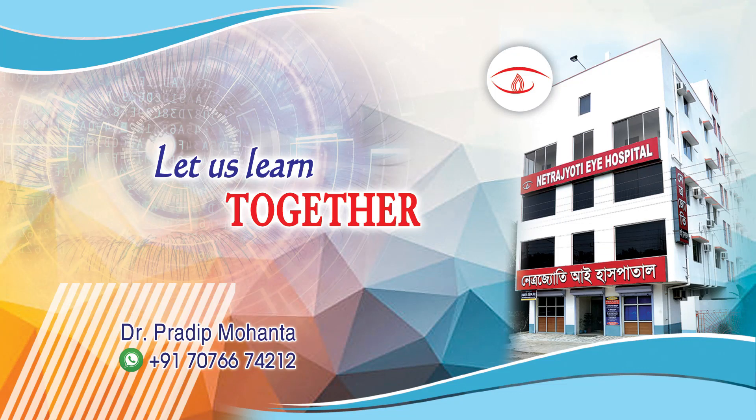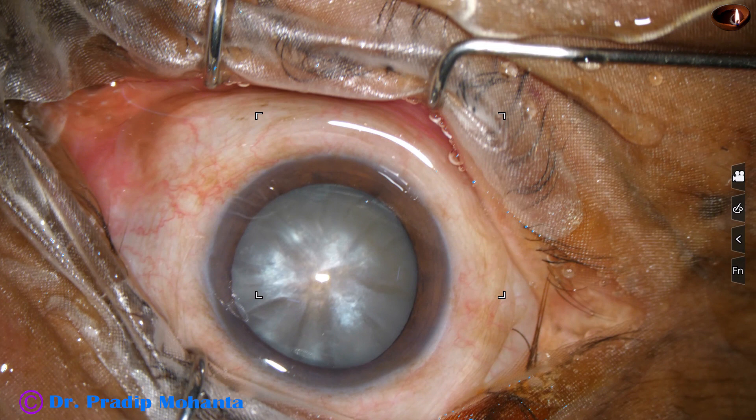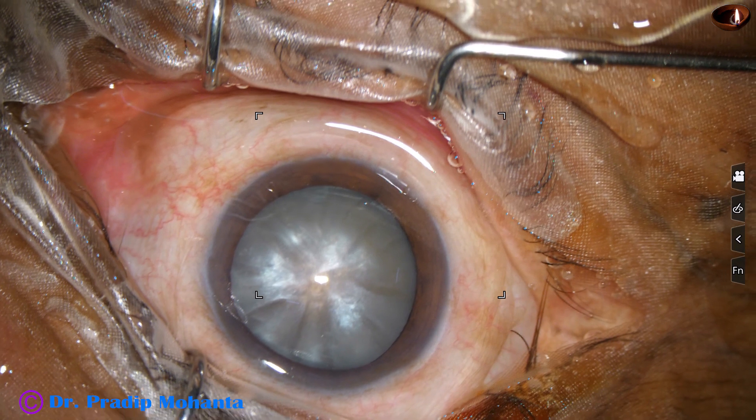Friends, welcome to my workplace at Ranaghat, West Bengal, India. This is an intumescent cataract. Let us watch the management of this case.